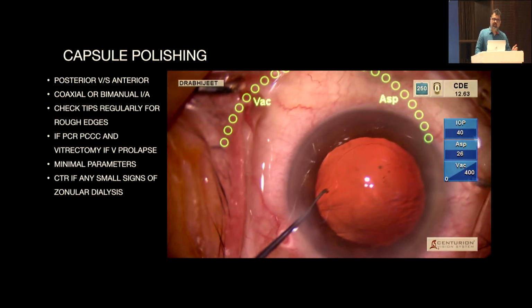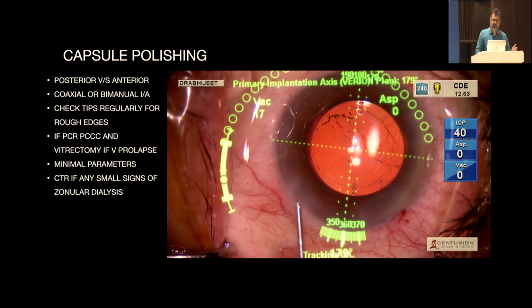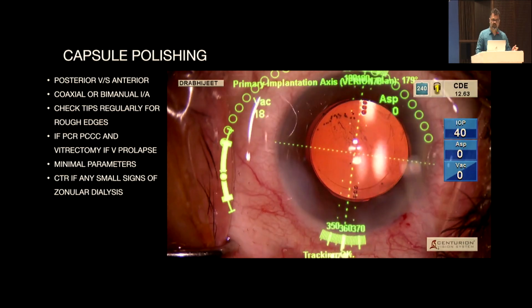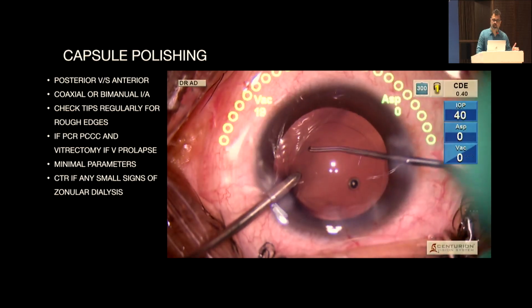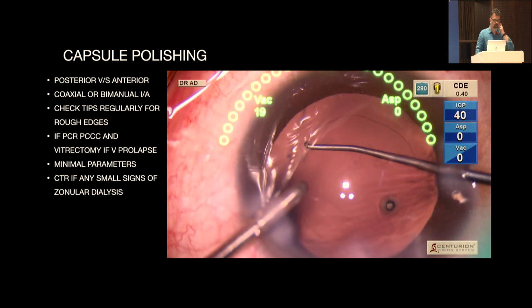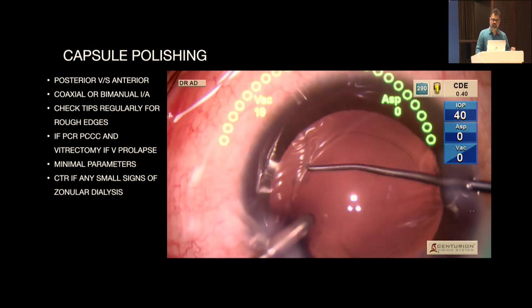Here you have to be very careful about peripheral PCRs, and that's the toric IOL here. It's not a multifocal though, but you can easily put it in the bag and get away with it. If it's larger than that and you don't have enough support, you definitely have to put in a monofocal IOL, and you'll have to come and talk to the patient about it and counsel them about it.